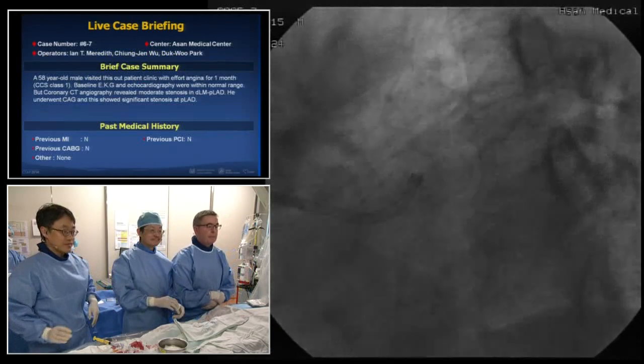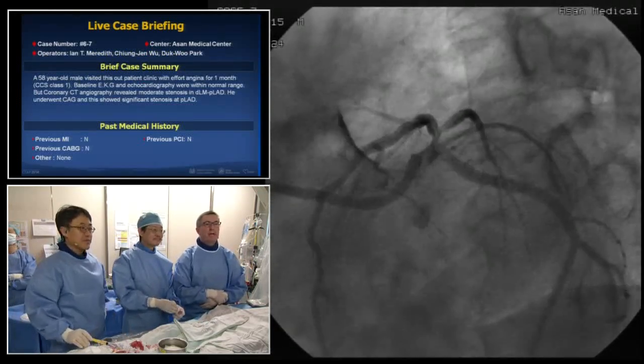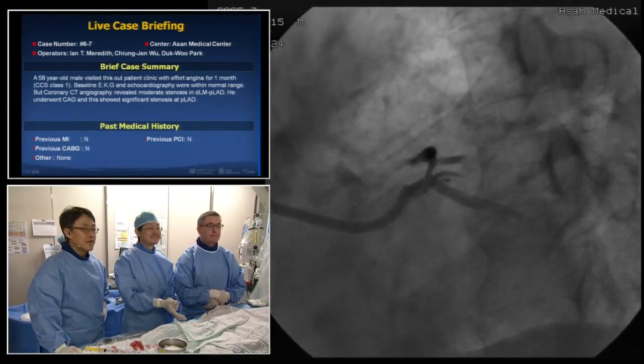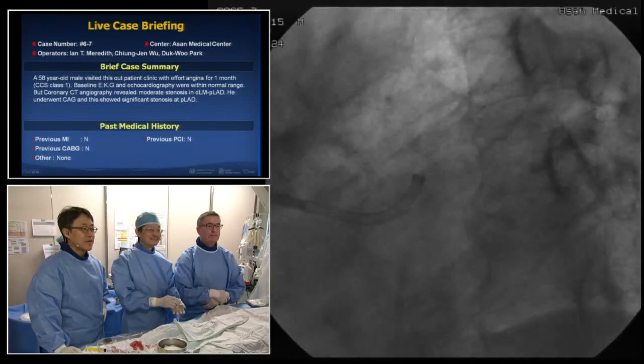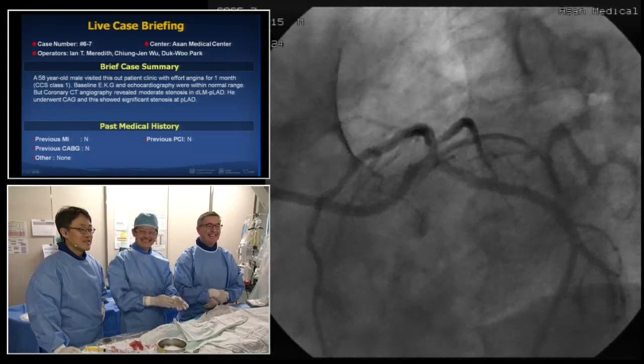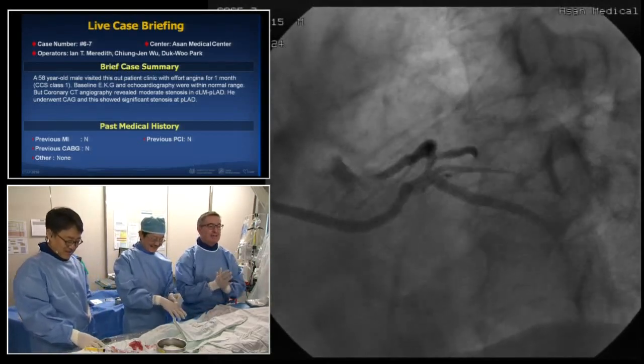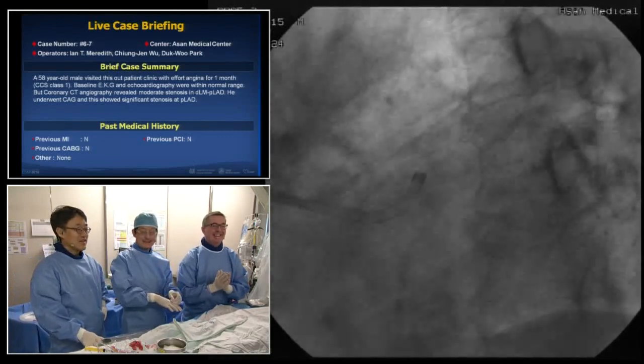Okay, so Maurice, do you want to make any comments about this? No, I think maybe you should start telling us what strategy you're thinking about. Marty just joined us now. He's a little short of breath, so we're going to let him... He might need an angiogram. Yeah. Okay. So go ahead, please.